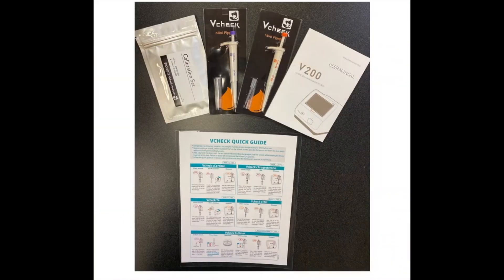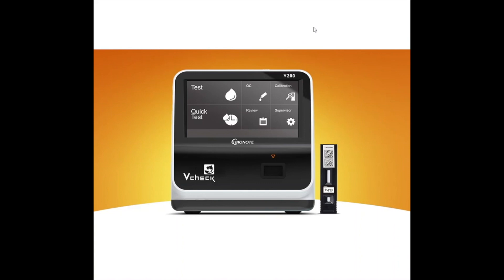It comes with everything you need to run a progesterone test: the two pipettes, the user manual, this is your calibration set, and a guide on how to run the samples. This instrument is very precise — it's correlated to an Emulite 1000, so this is really all you need. The basic unit comes with all of this as part of the sale price, along with a two-year replacement warranty plus ongoing support through email and telephone. All the test kits are provided for you here.